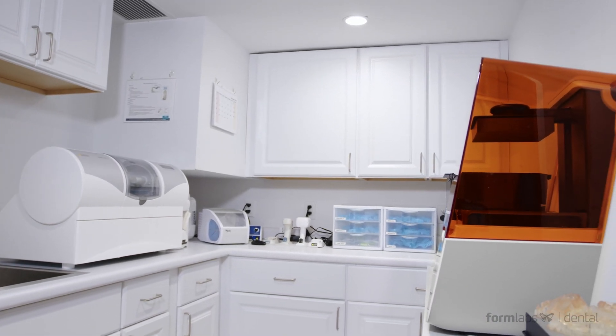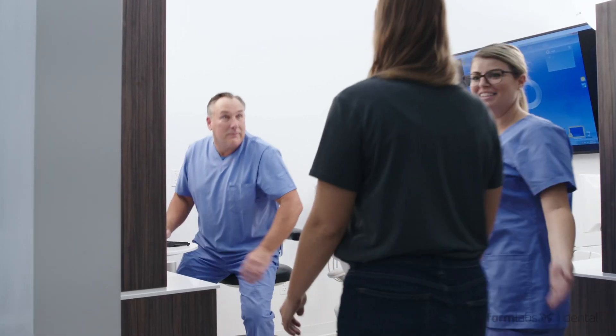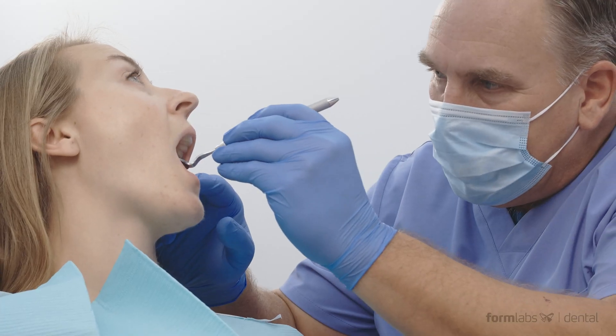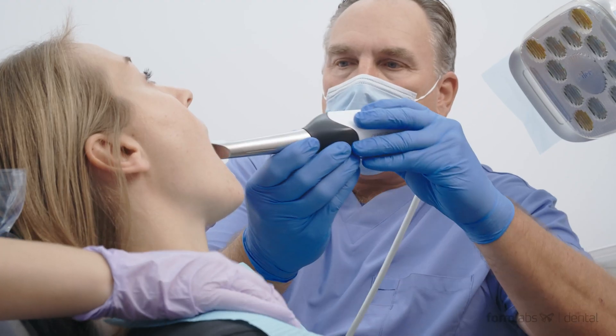The Form 3B provides dental practices with reliable, affordable, chair-side 3D printing of biocompatible products at a cost you can afford.